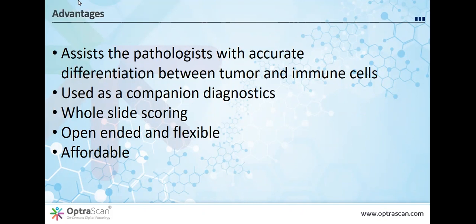I think that overlooks the fact that as pathologists, part of our job is, when we look down a microscope at a glass slide, if it's not adequate in terms of quality or stain, then we don't interpret it. We get another cut or another section or another stain. So we're not stupid. And this is the same with looking at scanned images. The scan has to have good quality and we have to be able to evaluate it.